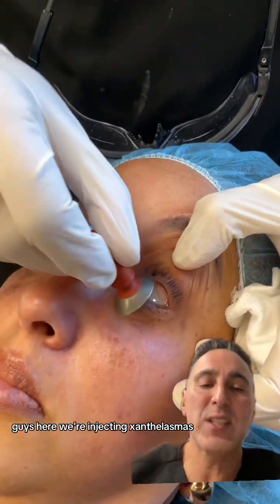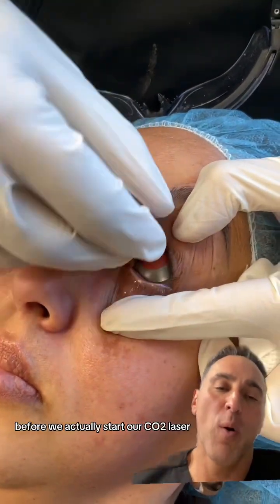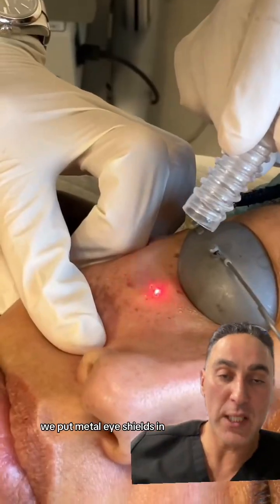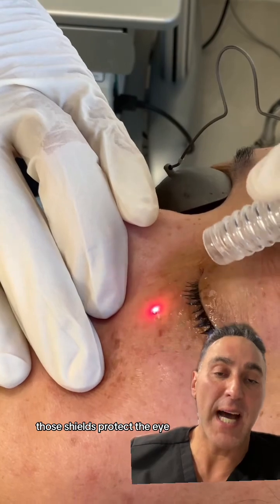Here we're injecting xanthalasmas. Before we actually start our CO2 laser, we put metal eye shields in. Those shields protect the eye.